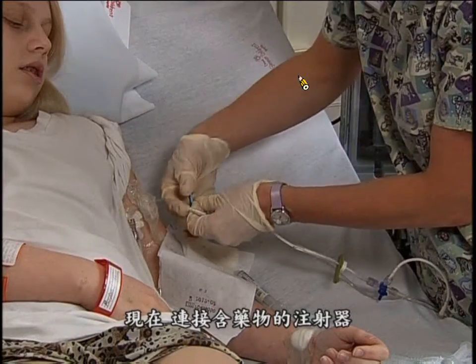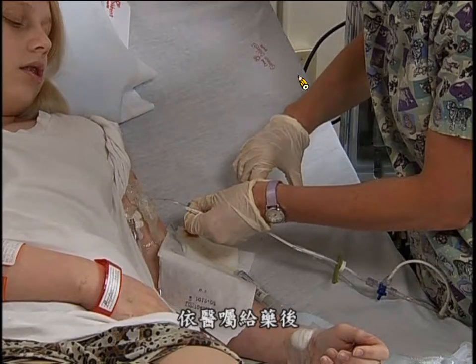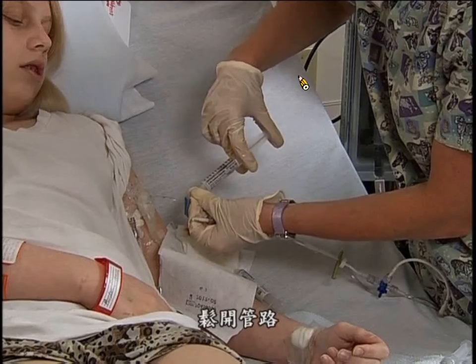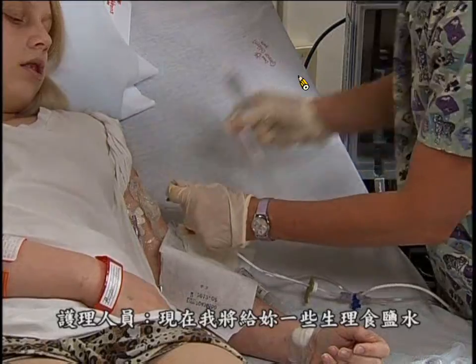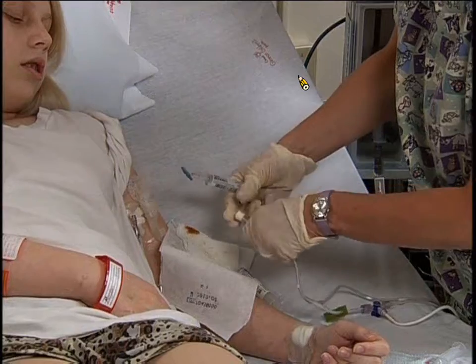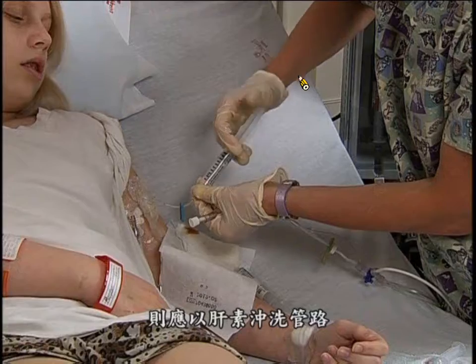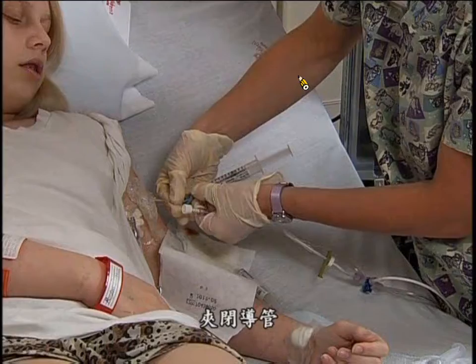Now attach the medication syringe, unclamp the tubing, give the medication as prescribed, and reclamp the tubing. Unclamp the tubing again and flush the catheter again with normal saline. I'm going to give you a little more saline. If no other medications or IV fluids are required, the catheter should be flushed with heparin. When the last flush is done, clamp the catheter.